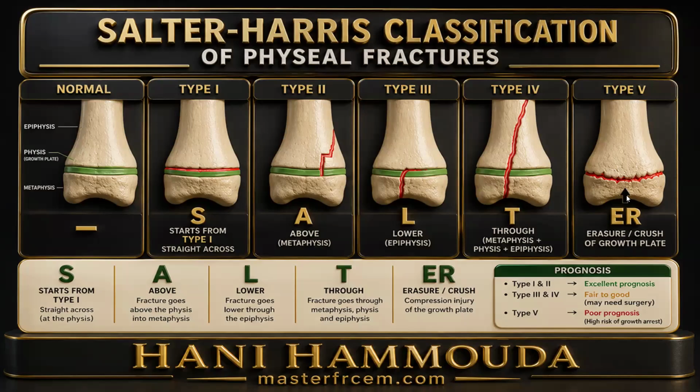Easy? Once you finish the explanation of each type, you will talk about prognosis.